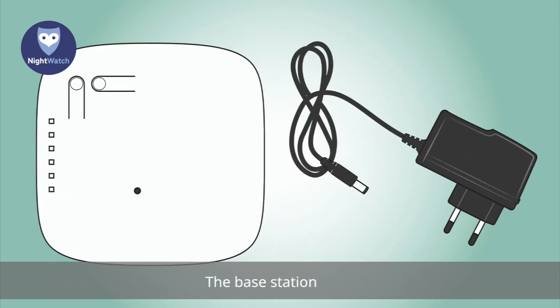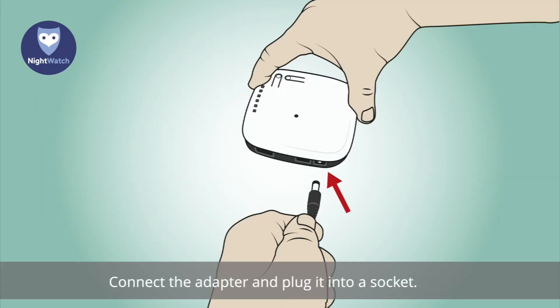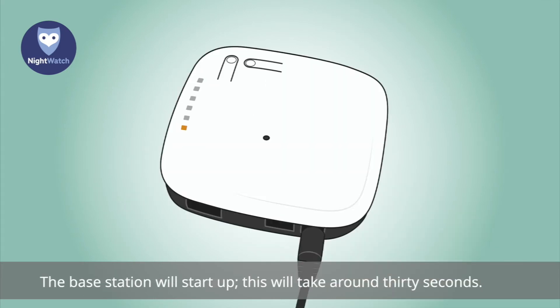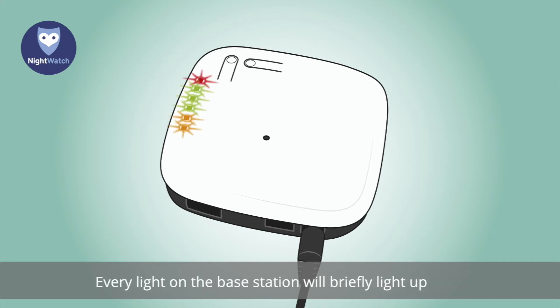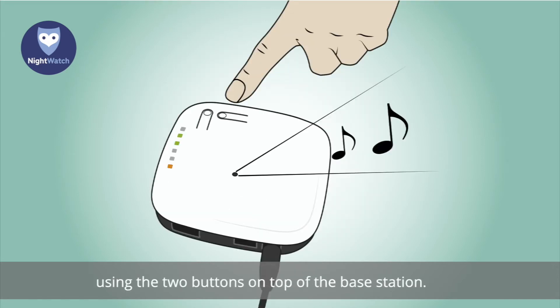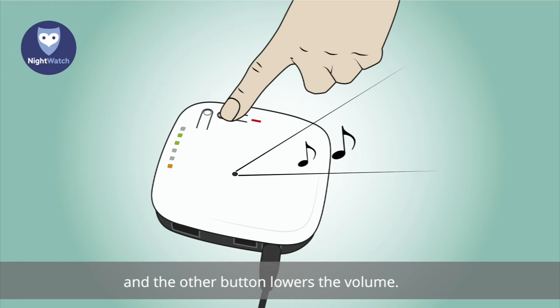For the base station, remove it and the black adapter from the travel case. Connect the adapter and plug it into a socket — the base station will start up, which will take around 30 seconds. Every light on the base station will briefly light up. As soon as one or two orange lights and two green lights are visible, the system has completed its startup. Now set the desired alert volume using the two buttons on top of the base station — one button increases the volume and the other lowers it.